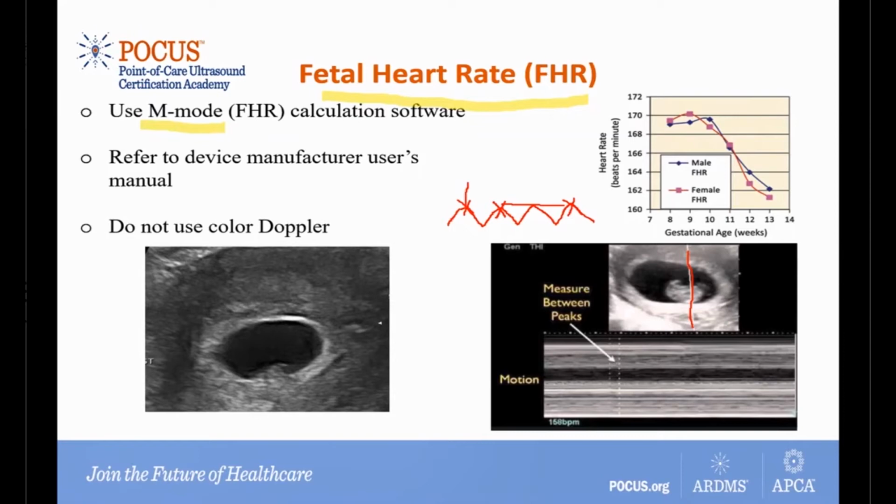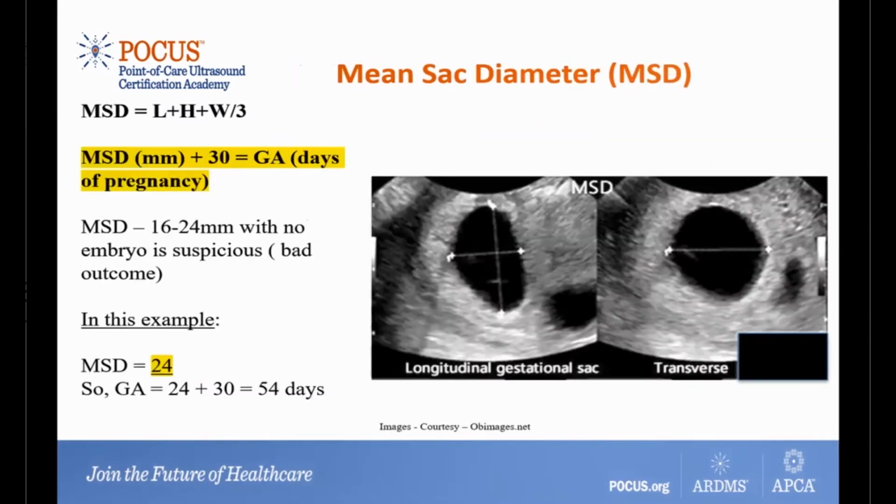One of the measurements that we perform to determine gestational age during the first trimester is known as the mean sac diameter. MSD stands for mean sac diameter, and mean means you have to take 3 measurements, add them together, and divide by 3. That would give us the mean. The system automatically calculates and displays it after you measure them.